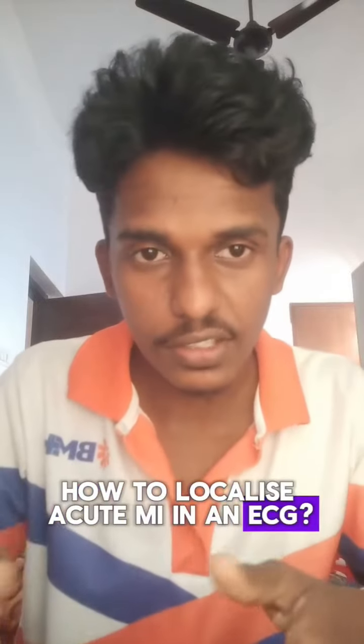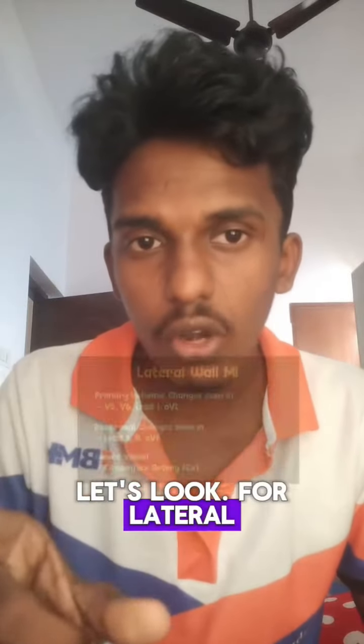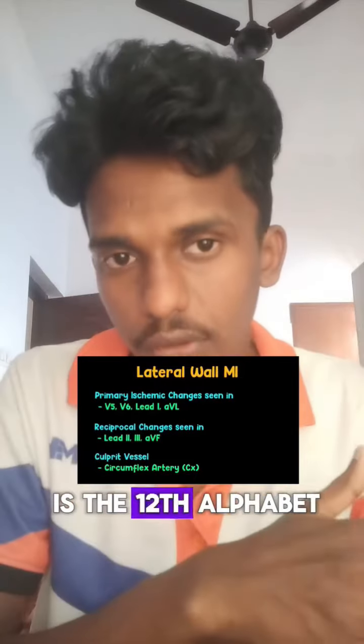Localize acute MI in an ECG. That is very easy. Let's look. For lateral wall MI, remember L is the 12th alphabet.